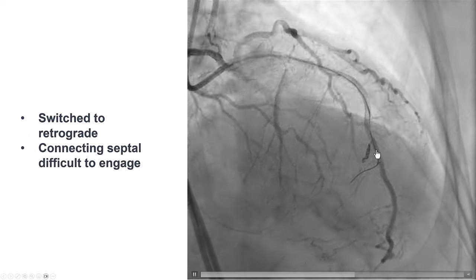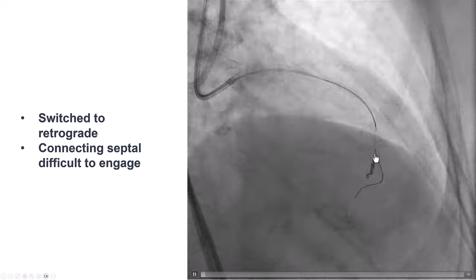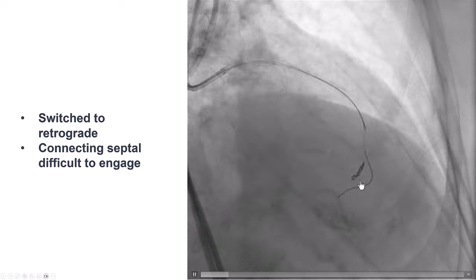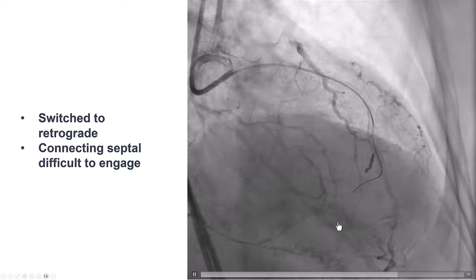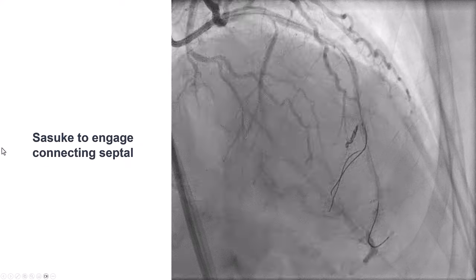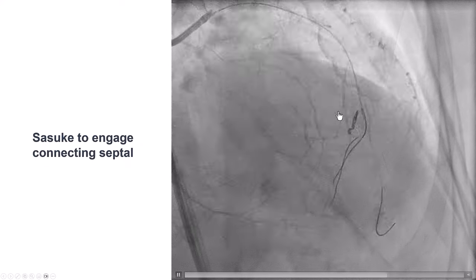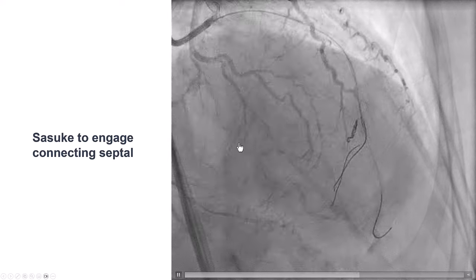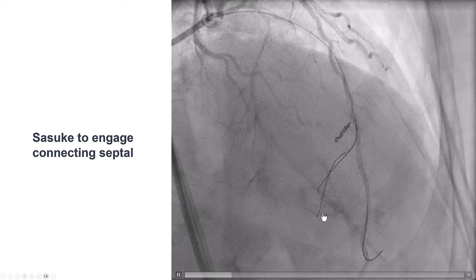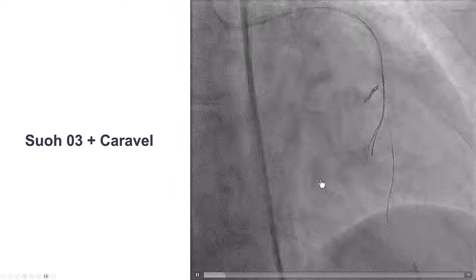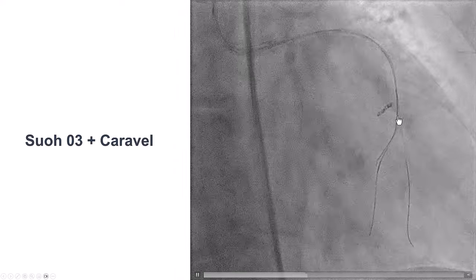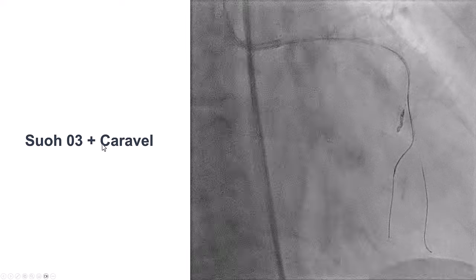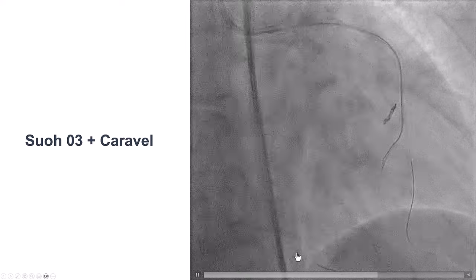We decided to switch to the retrograde approach. This time we were very careful to select the right collateral, but the wire kept entering a septal that was not connecting with the PDA. After multiple attempts, we left one wire in place to mark where not to go, then used a dual-lumen microcatheter — a Sasuke — to advance the guide wire to the septal that was actually connecting.